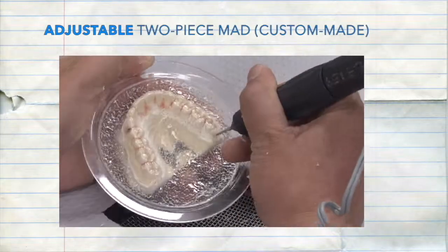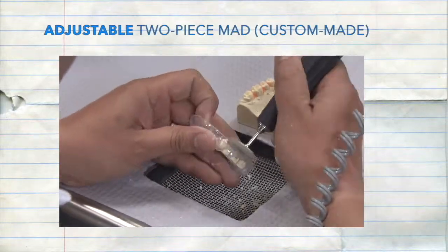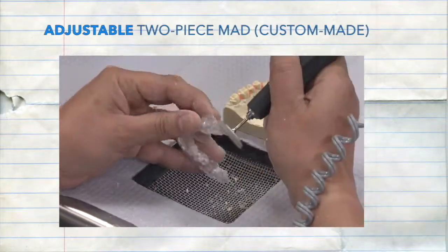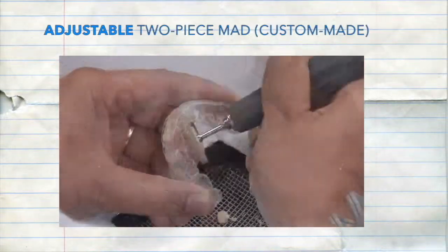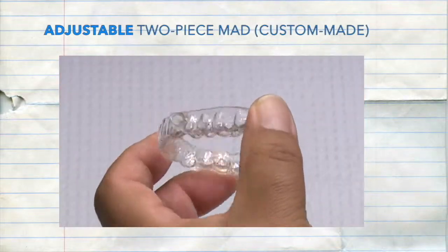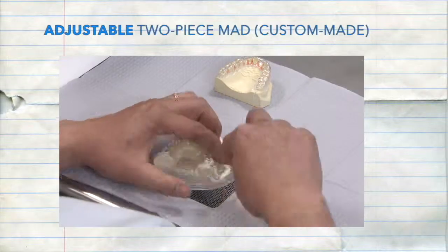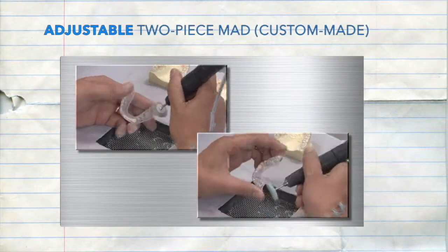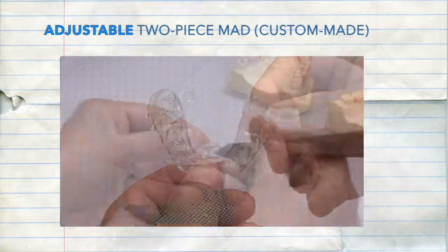Place the model on the vacuum former, ready the vacuum forming disc in the foil holder, and heat the disc until it is ready to be pressed down into the cast. Then let it cool down. Cut the excess foil around the device and remove it from the cast. Smoothen out the edges of the device and follow the shape of the teeth. Use the same procedure with the other cast.